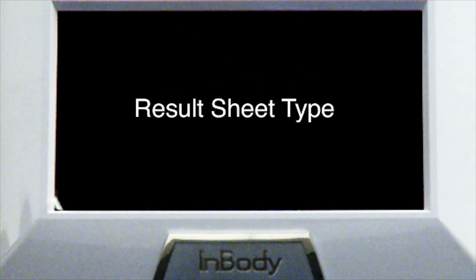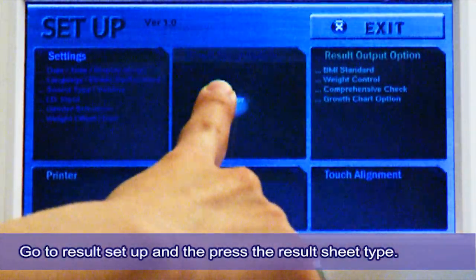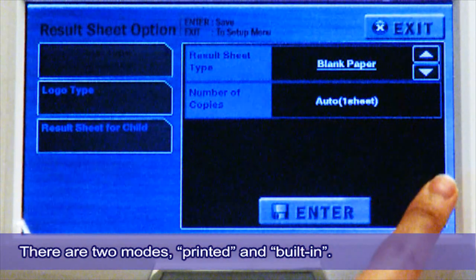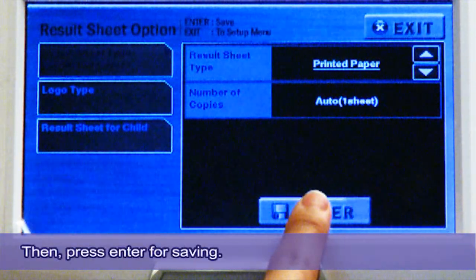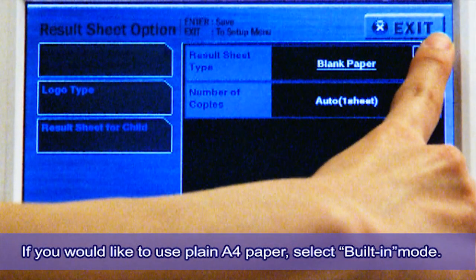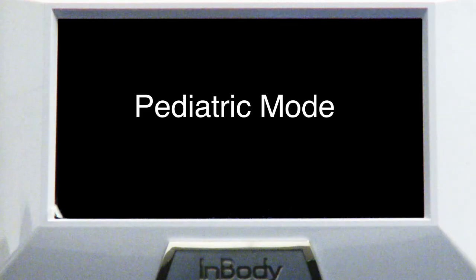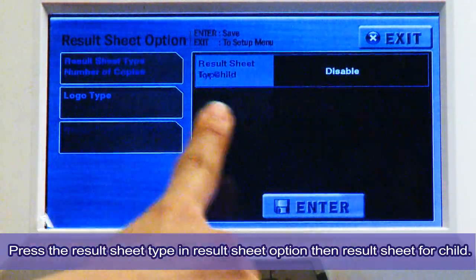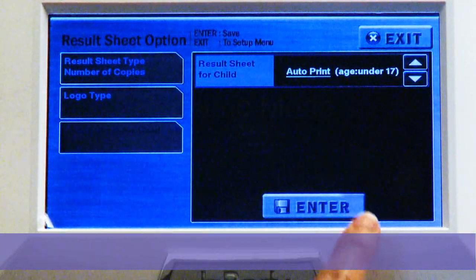Result Sheet Type: to modify the Result Sheet Type, go to Setup and then press Result Sheet Type and Result Sheet Option. There are two modes: Printed and Built In. Select Printed to use the Result Sheets provided by Biospace, then press Enter for saving. If you would like to use plain A4 paper, select Built In mode. For Pediatric Mode, press Result Sheet Type and Result Sheet Option, then Result Sheet for Child. Choose Enable for the Pediatric Mode and press Enter for saving.